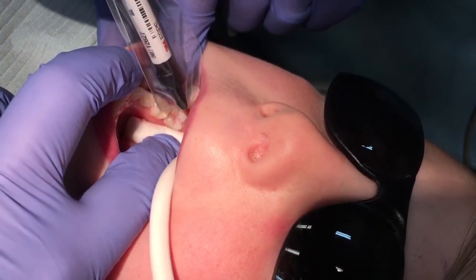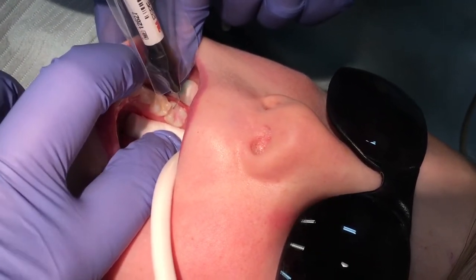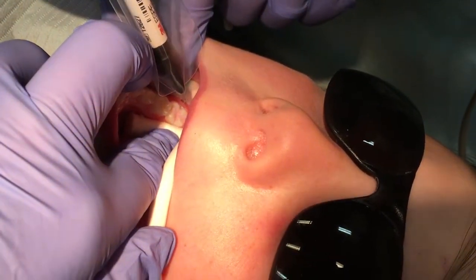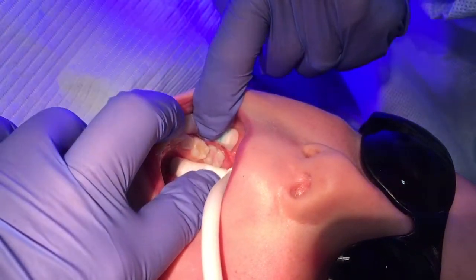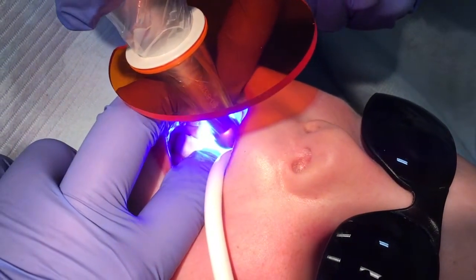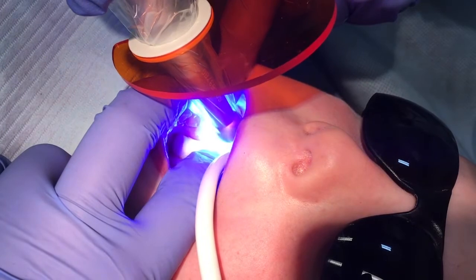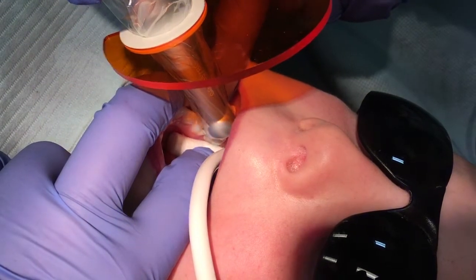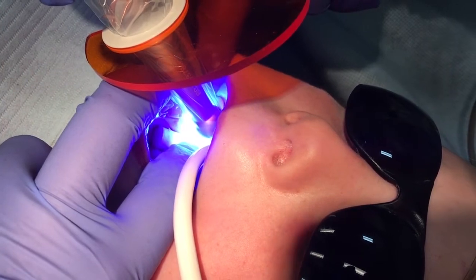Run the sealant tip through the sealant to remove voids or bubbles. If necessary, remove excess sealant material with a sponge tip applicator. An overfilled sealant is more likely to be lost due to constant occlusal interference. Cure the sealant for as long as recommended by the cure light manufacturer, as the recommended times may vary. Use a cure light meter periodically to test the intensity of your curing light. Several curing light meters are available at a reasonable cost. The older halogen lights require a greater length of curing time compared to the newer LED rechargeable lights.